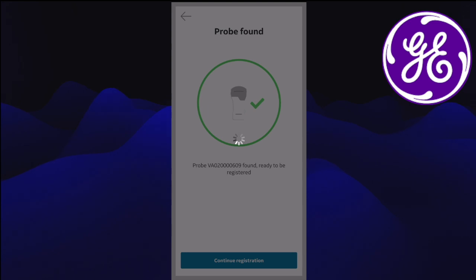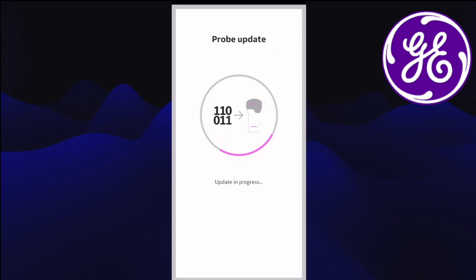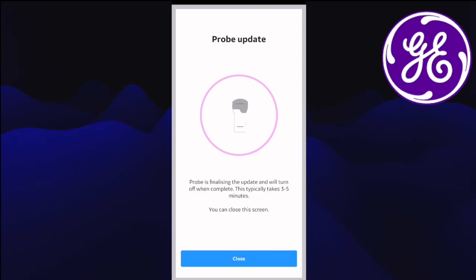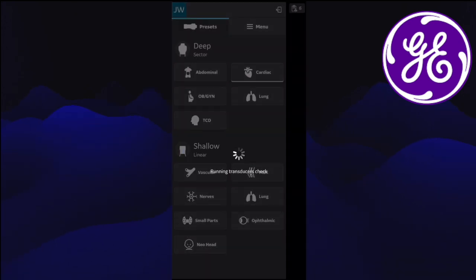The next screen shows the probe needs a firmware update, so it goes through the process and updates itself, flashing purple. This didn't take long at all — just a few minutes basically. Then we've got the usual system set-up and we're ready to scan. Very intuitive.